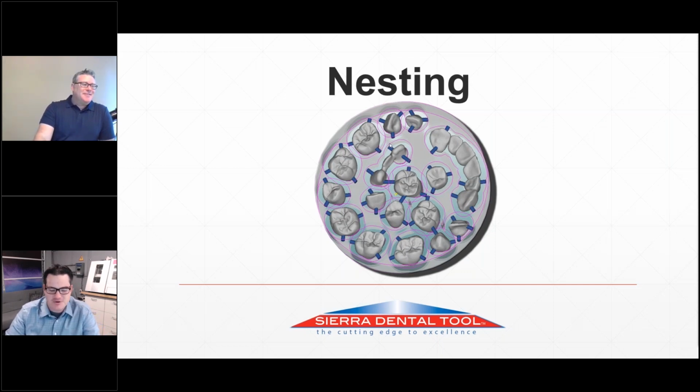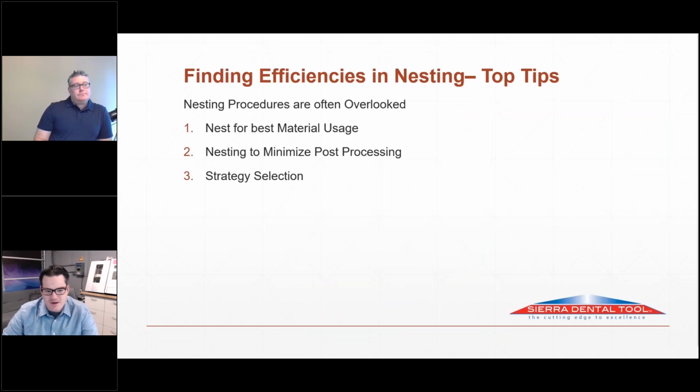Oh, for sure. So once our design's done and we're all happy with it, we've got to get it nested. In both Nick's and my experience talking to labs, most labs tend to overlook this step in terms of how they can gain efficiencies and get rid of waste in their process.